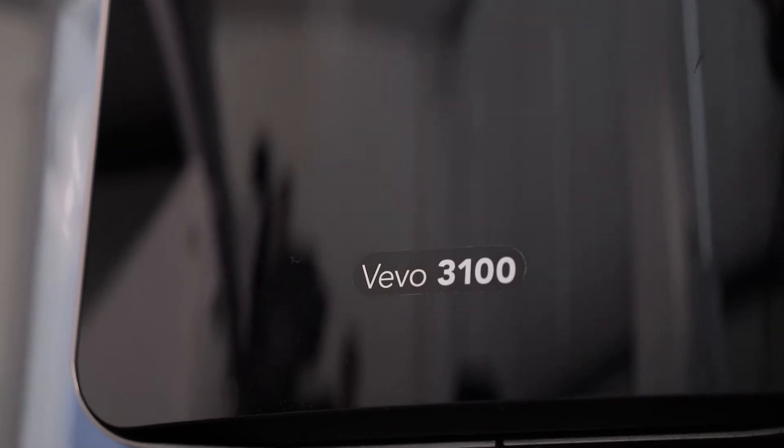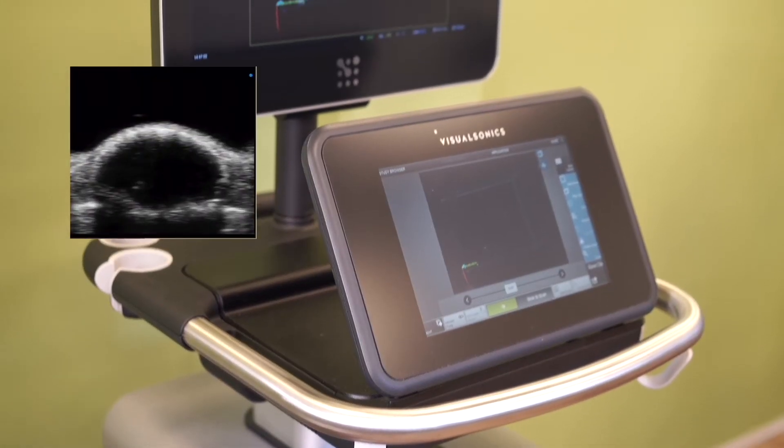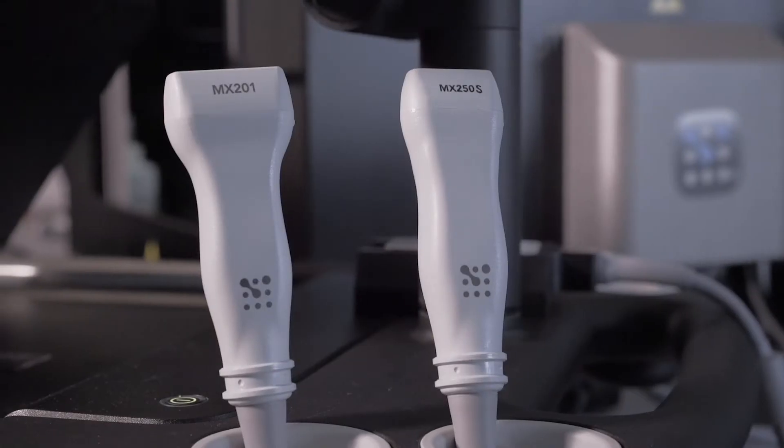Welcome to our short introduction on the Vivo LaserX system. This unique multi-modality system combines ultra-high frequency ultrasound and photoacoustics to gather anatomical, functional, and molecular information from just one exam.